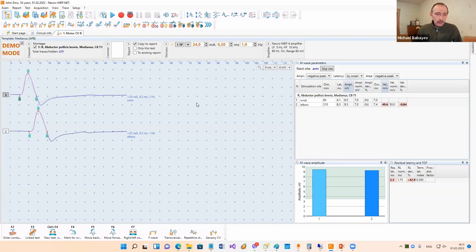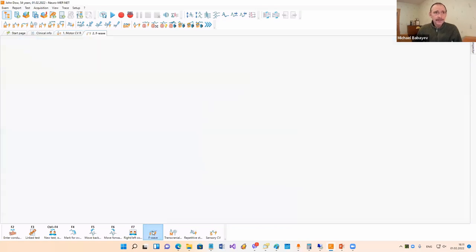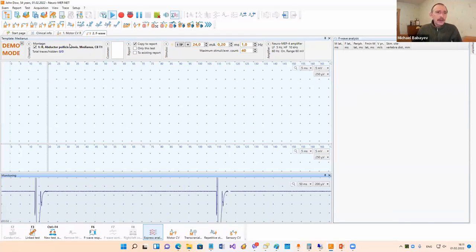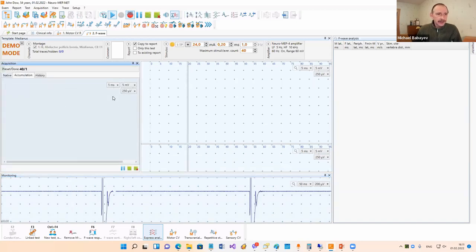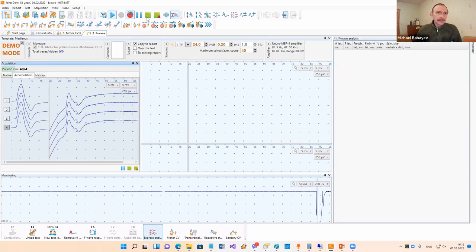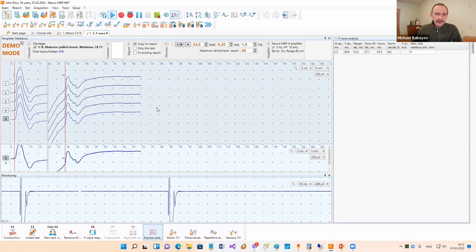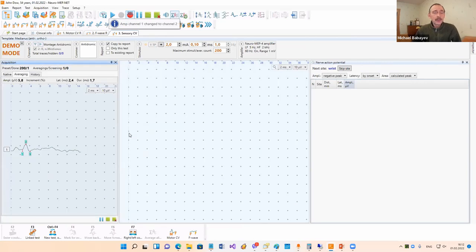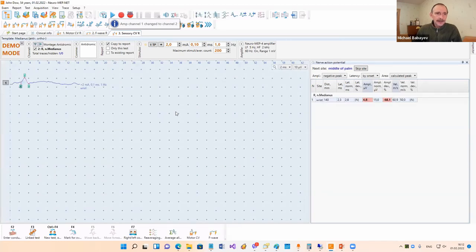Then we can go to some other test, for example the F-wave test. With one mouse click we go to the F-wave test with the same recording site. We can start stimulation here, record F-waves, and put them into analysis. Then we can go to sensory conduction velocity with the same nerve, start acquisition with averaging, stop it, and put it into analysis.